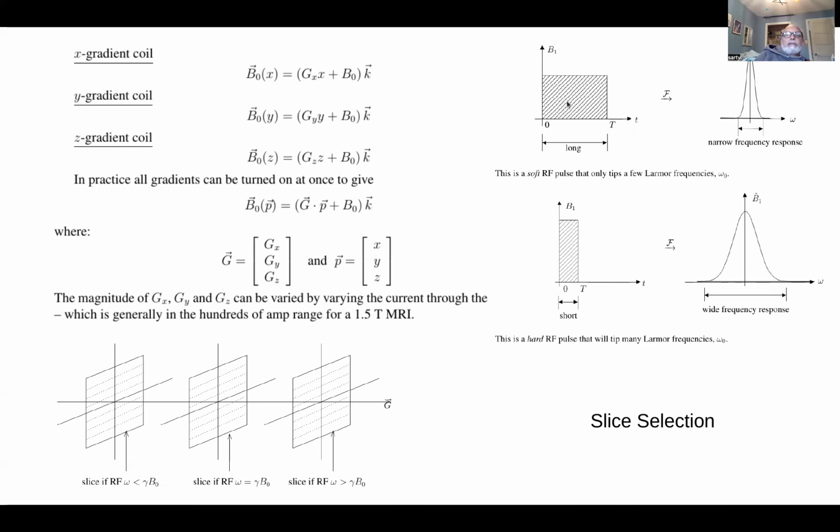If we go from position space to momentum space, a large delta in position will lead to a small delta in momentum. Momentum is frequency in quantum physics. So basically, if you want to understand which frequencies are affected by your RF pulse, you have to know what the resonant frequencies of your spins are that it's going after. A long pulse will only have a few frequencies in it, whereas a short one will have a lot. So you'll end up affecting more frequencies here than here. Does that clarify it at all?